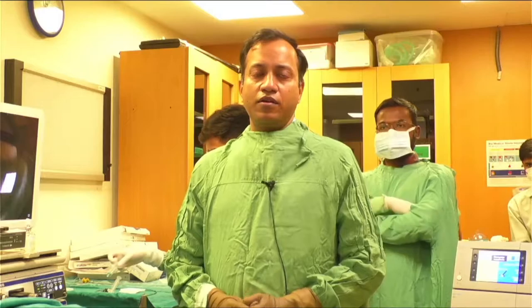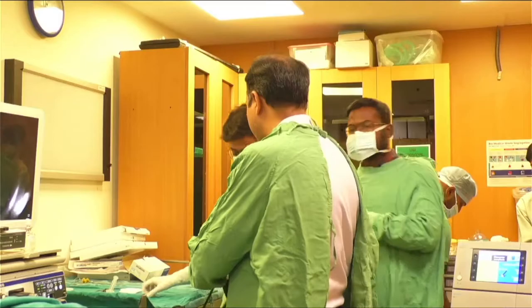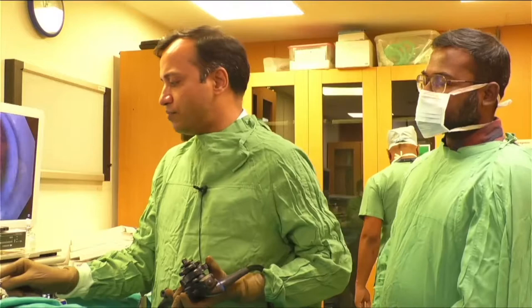Hi, today we are going to explain how we do the POEM procedure. This is a patient with type 2 achalasia cardia and we are going to perform posterior peroral endoscopic myotomy. We are using the Olympus 190 HQ scope. The patient is intubated and lying in the supine position.